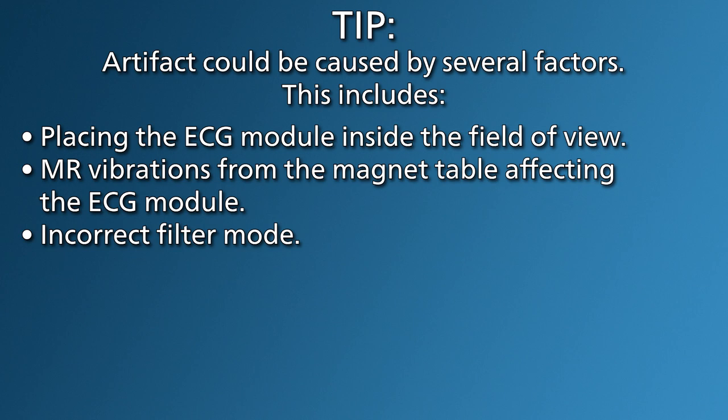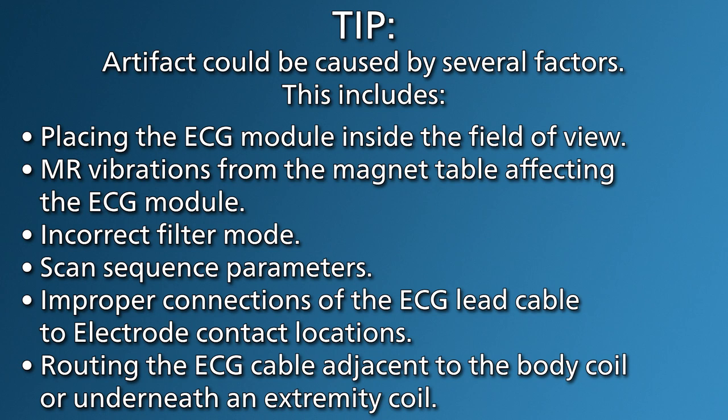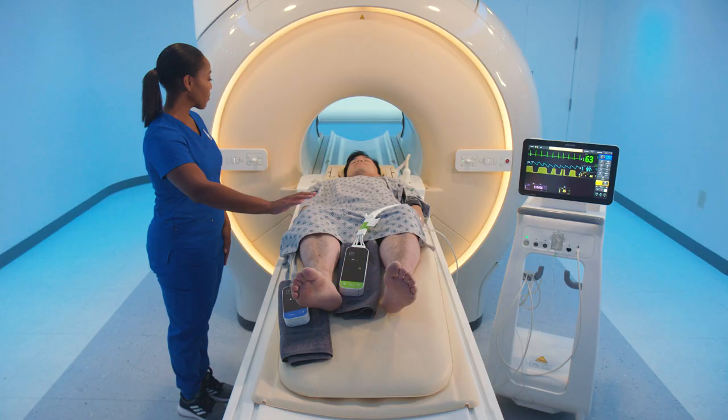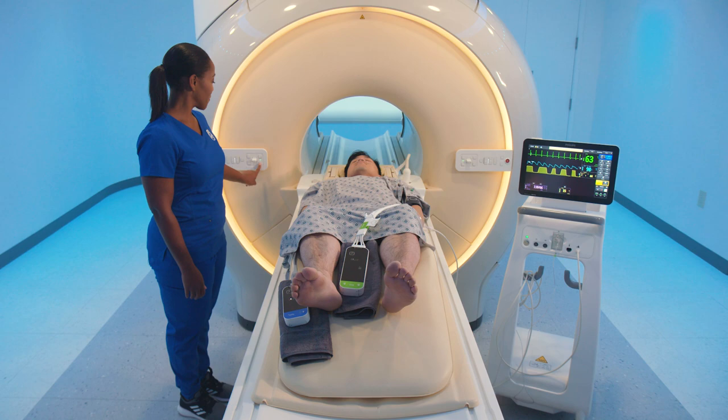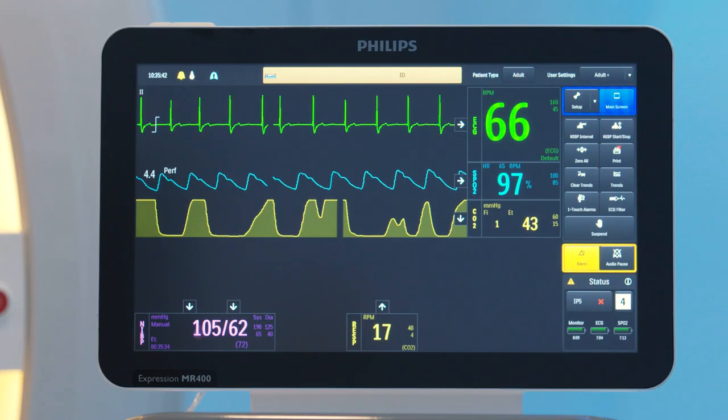incorrect filter mode, scan sequence parameters, improper connections of the ECG lead cable to electrode contact locations. Routing the ECG cable adjacent to the body coil or underneath an extremity coil. Be sure to follow all instructions for ECG preparation to minimize artifact and optimize ECG signal strength. For additional instructions on ECG monitoring, please refer to your monitor's instructions for use.